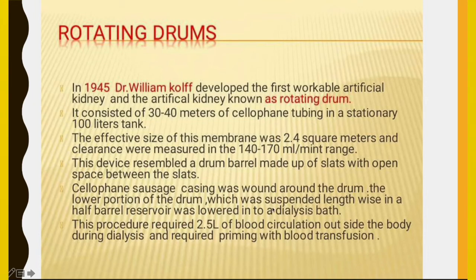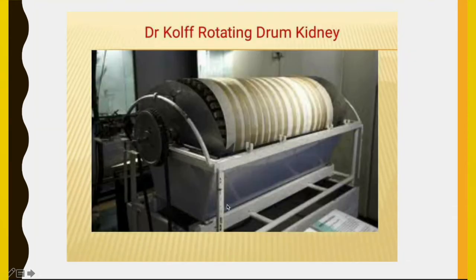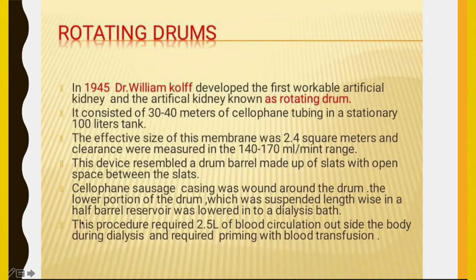The lower portion of the drum, which was suspended lengthwise in the half barrel reservoir, was lowered in the dialysis bath. So here this is the dialysis bath. Here the dialyzer, or we can say the barrel, was half dipped into this tank.